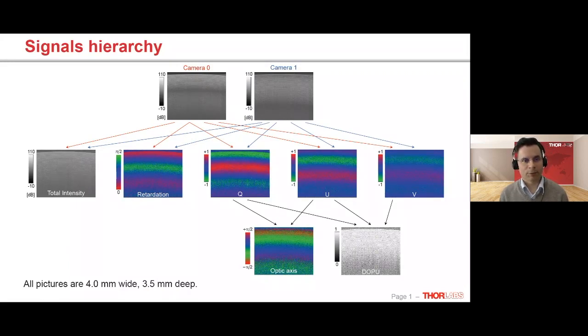And from those reflection coefficients, we can reconstruct the electrical field, up to a factor. And then to obtain the Q and V, it's just a mathematical combination of them as complex quantities. It's a very straightforward computation.